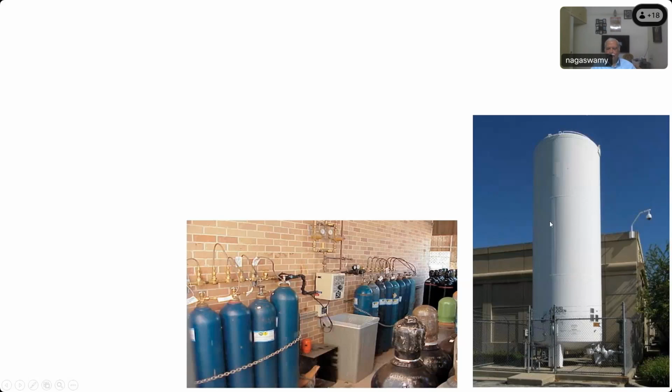Open area. It should always be kept in the open, and it should be far away from the main buildings. Okay, and it should always have a good basic solid concrete flooring to bear the weight of the cylinder, and it will be fenced. People should not be able to go closer to that. It should always be fenced and kept away from that. And what is the name for this plant in medical terminology?